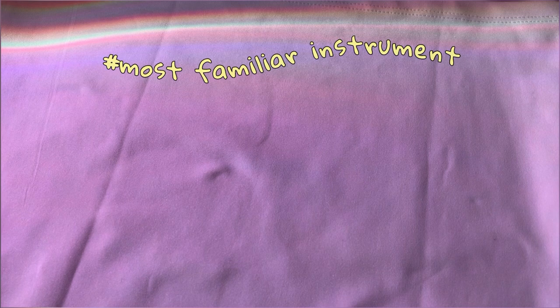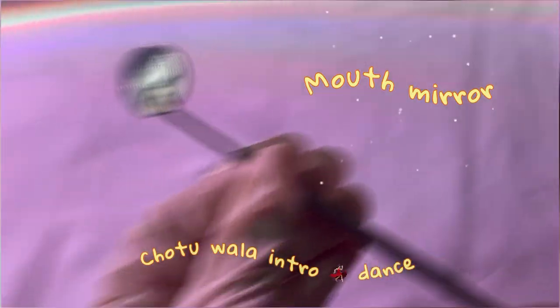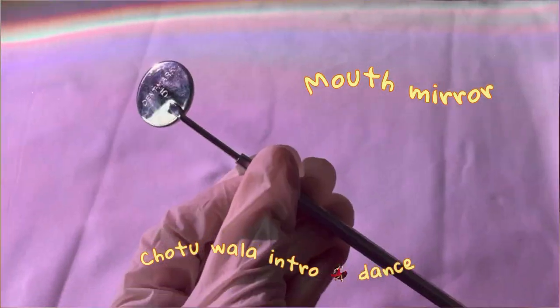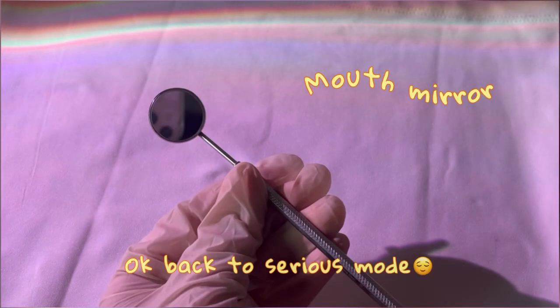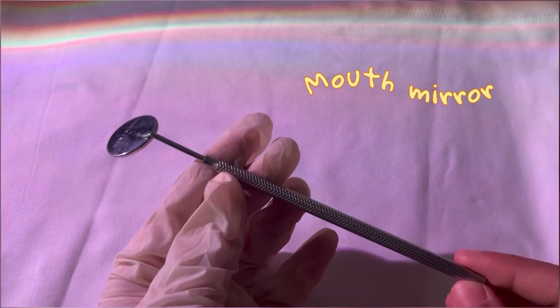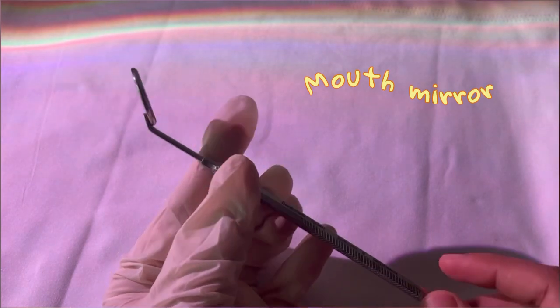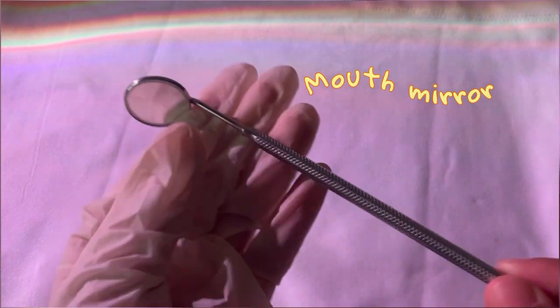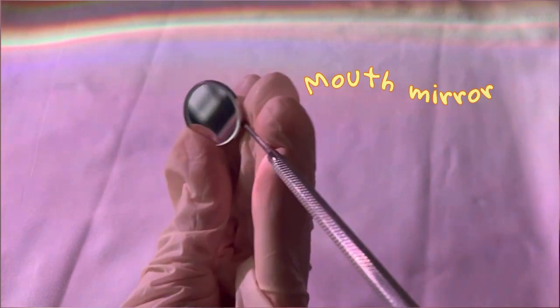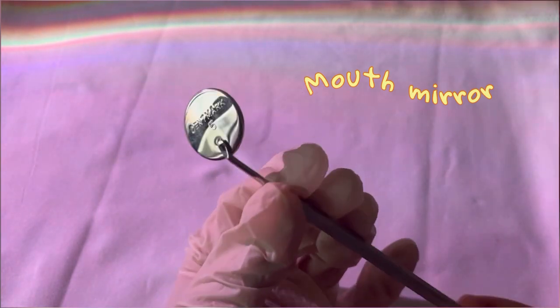Let's start with the most familiar thing you have already seen in the GDC kit — it is nothing but the mouth mirror. This is called a mouth mirror. You might have seen this in movies, serials, or on Netflix, where you see a dentist putting it inside a patient's mouth to examine what's inside or to check the posterior teeth.